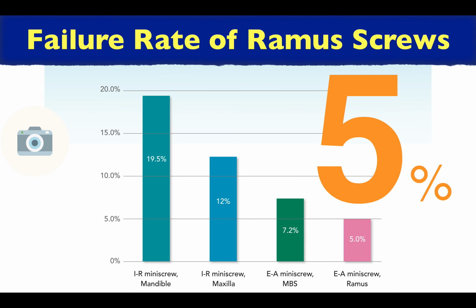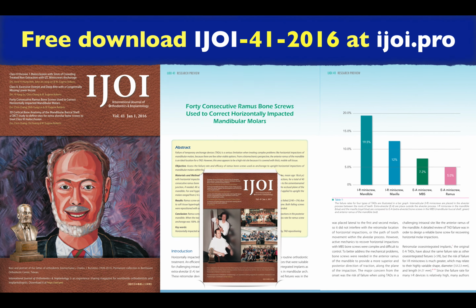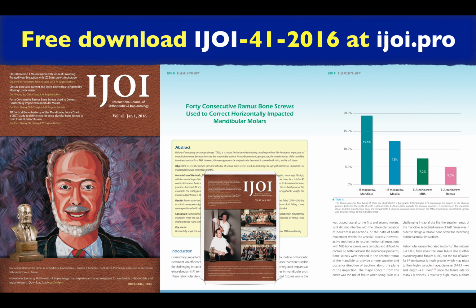What is the failure rate for this buccal Ramus screw? 5%. If you are interested in this Ramus screw study, you can find it in this journal, and you can download it for free.